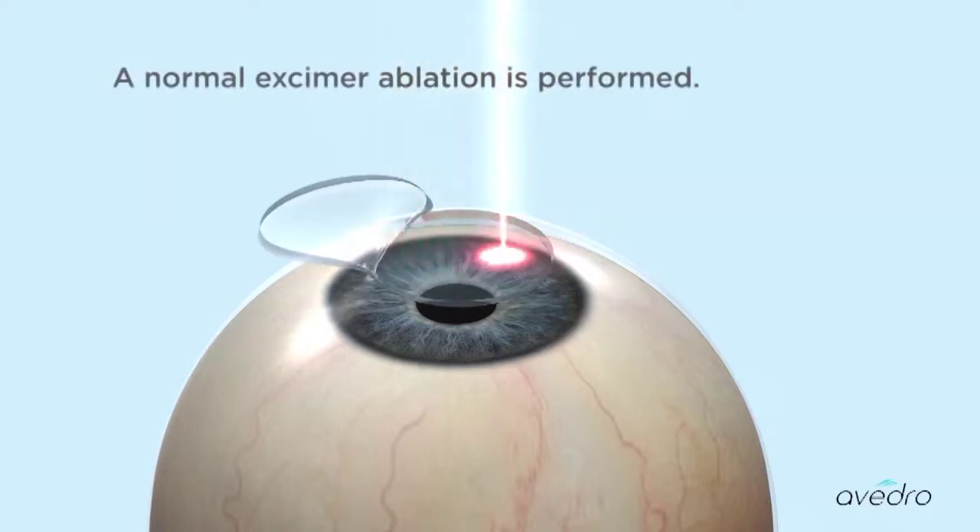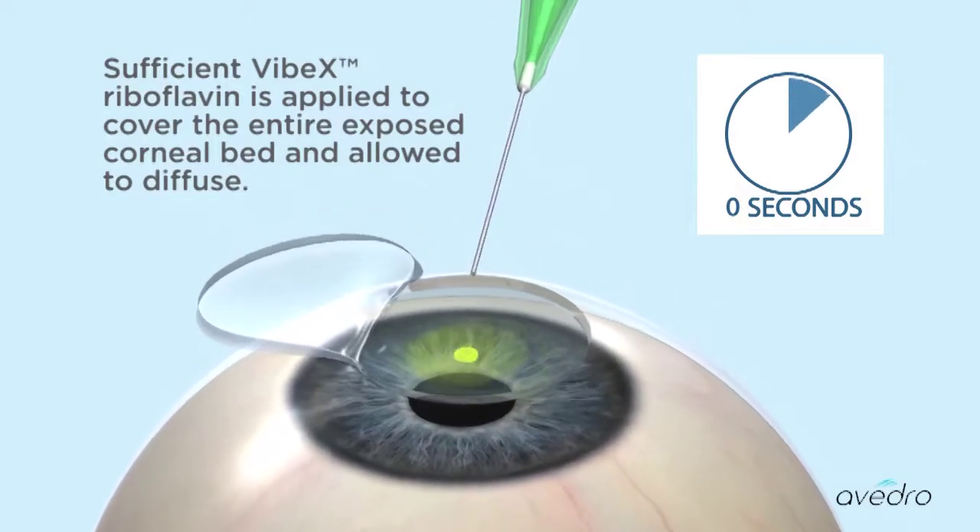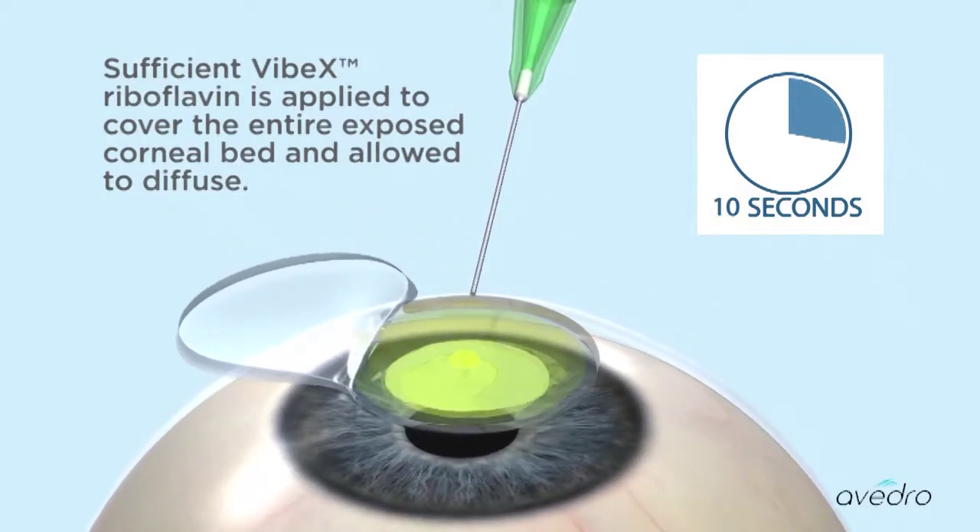A normal excimer ablation is performed. Sufficient Vibex riboflavin is applied to cover the entire exposed corneal bed and allowed to diffuse.